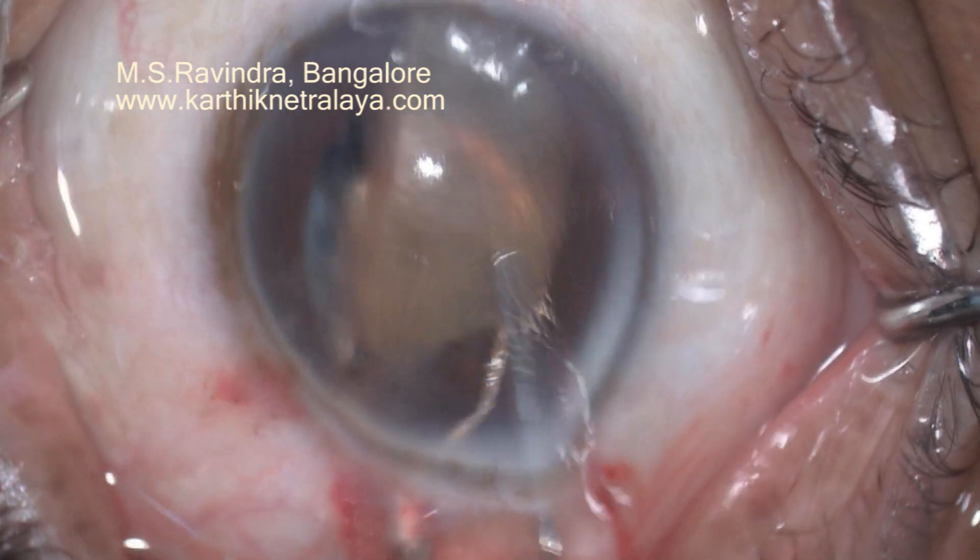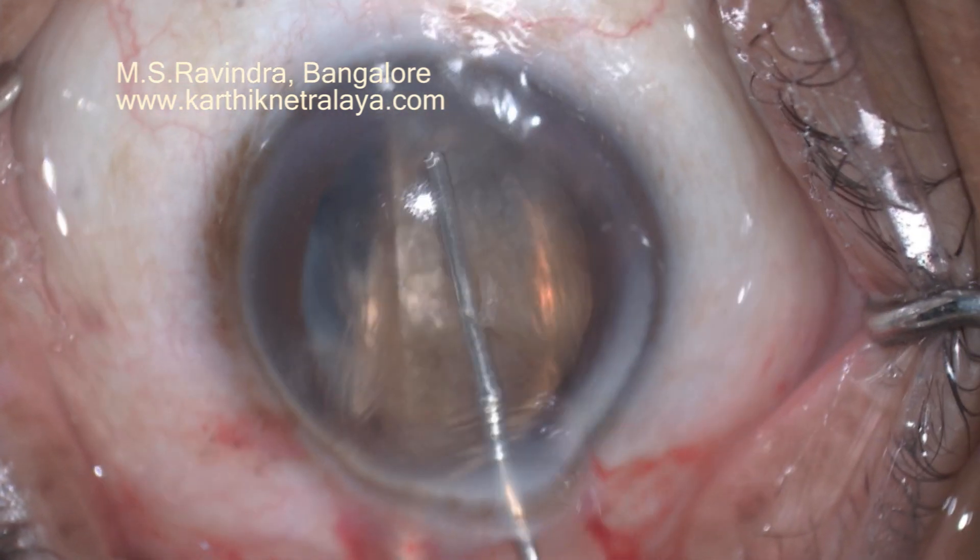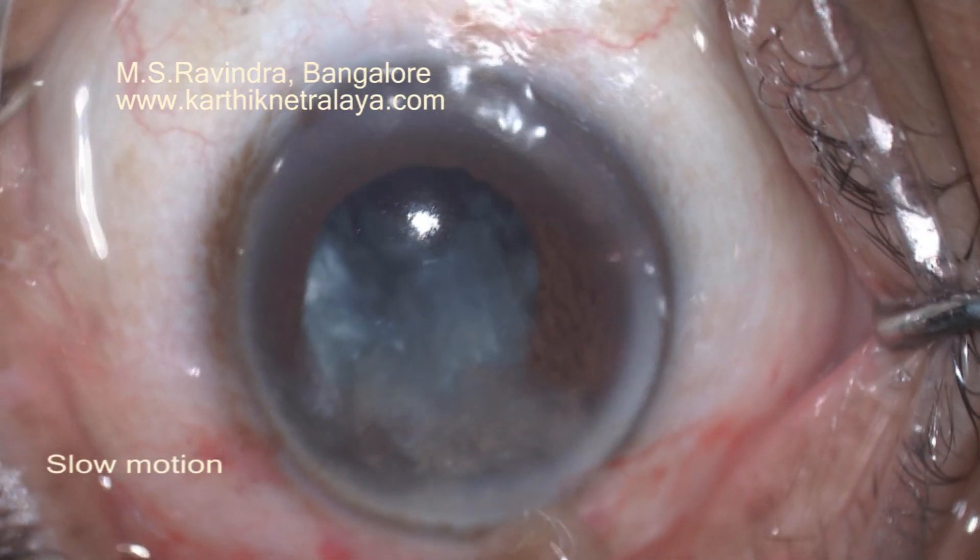There is no side port. You can see that the visco is being injected continuously as the nucleus is sliding out. Let us see it in slow motion.